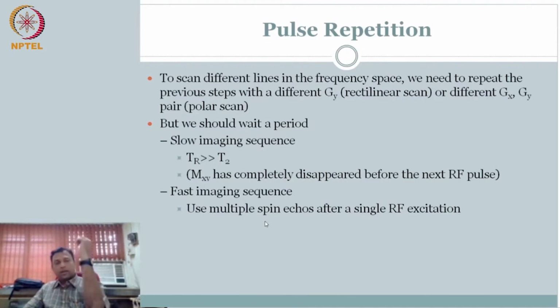Whole idea is I'm getting the signal from Z, from a volume, right? From a slice thickness. How did we do that? We applied a Z gradient. Not only that, if you only apply Z gradient, you don't get signal because it is all cancelling. We applied a polarity switch for a short duration. So we made what is called a refocusing pulse in Z gradient. Why did we do that? When you do the refocusing, it will focus back and the signal will start to appear.